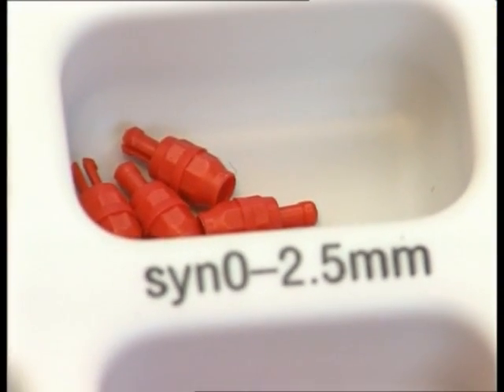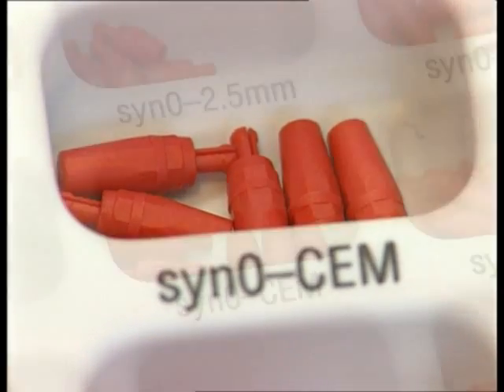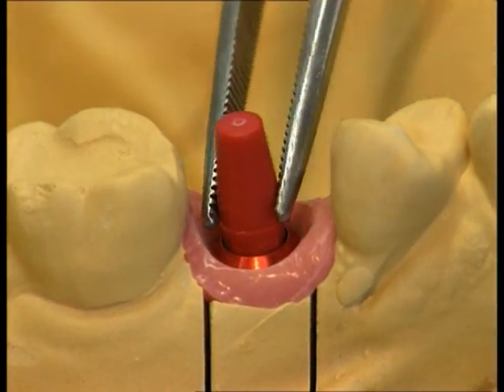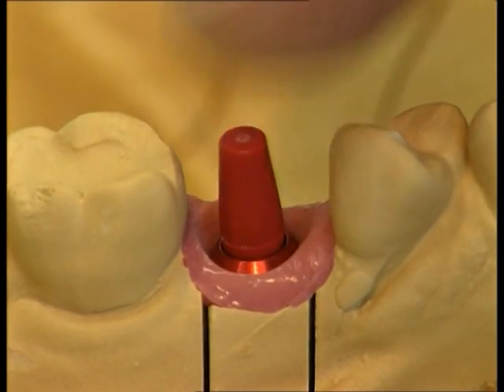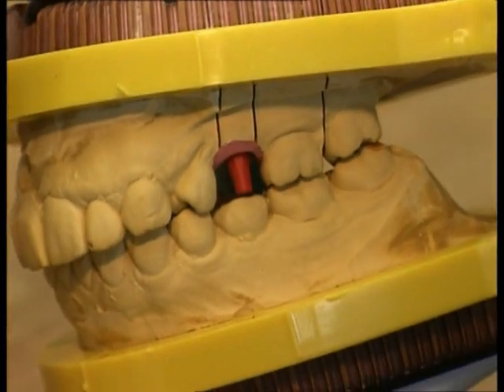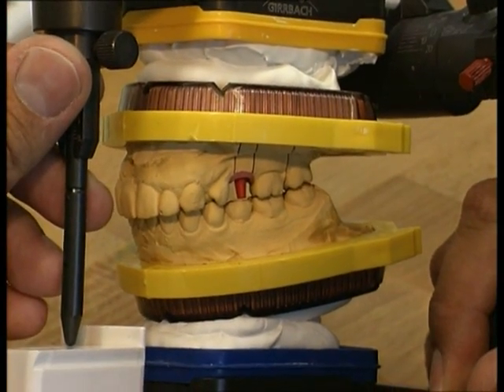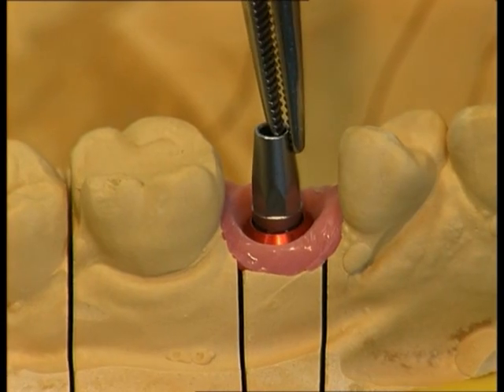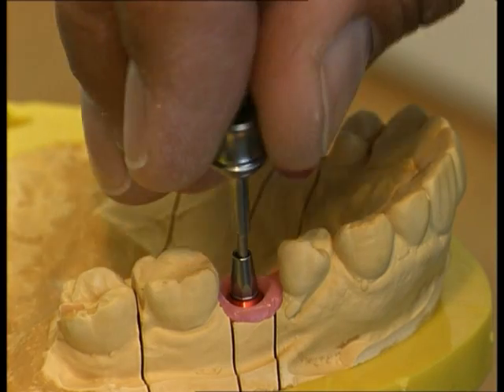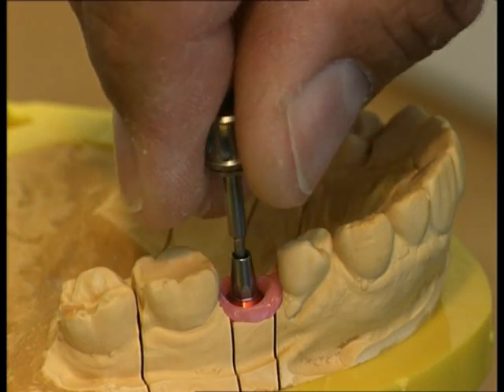This planning kit includes plastic try-in abutments for crowns and bridges that can be placed on the implant analogues to verify their heights and axial inclinations. First, the dental technician hand tightens the Synocta cemented abutments in place on the analogues using the SCS screwdriver. Care must be taken to ensure that the abutment is placed within the octagon of the analogue.